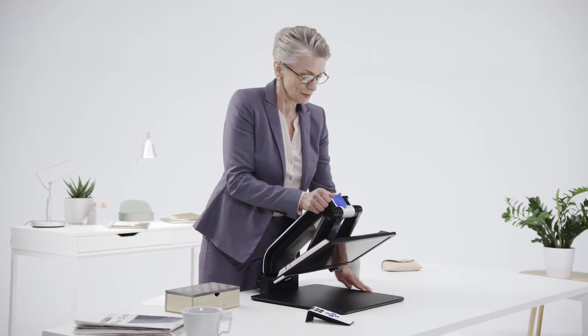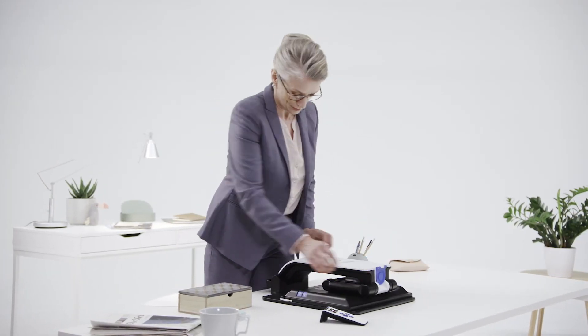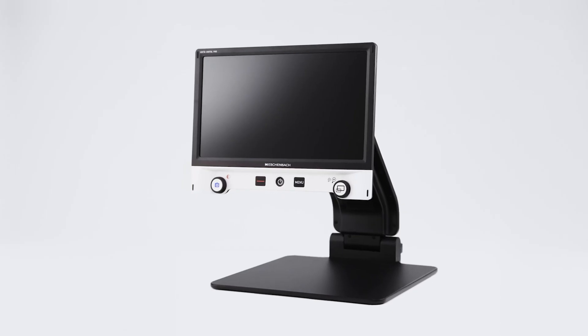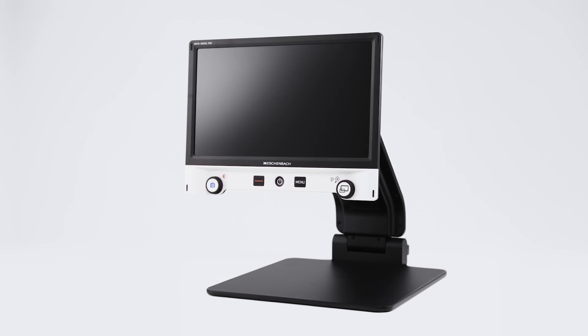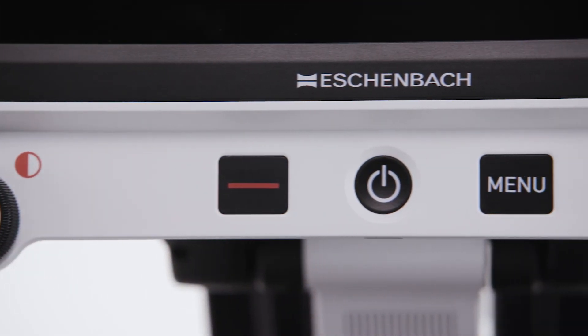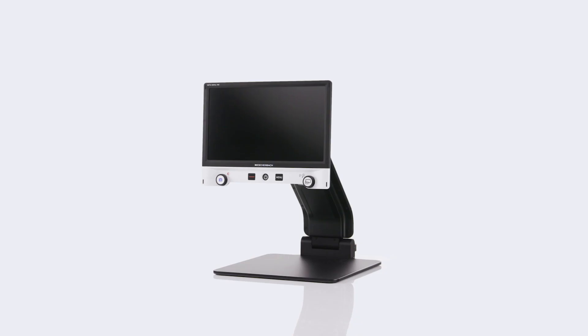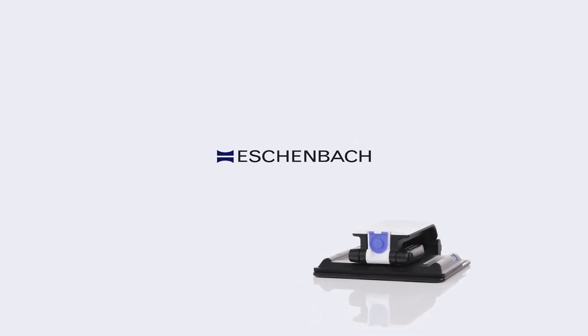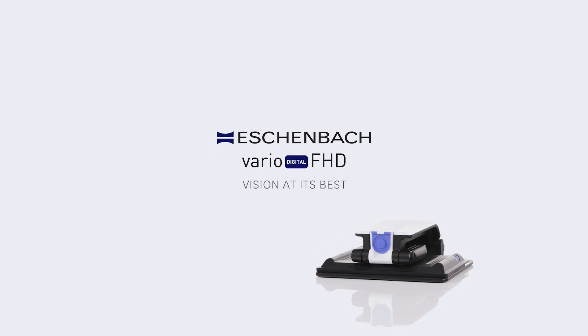The Vario Digital FHD combines flexible design with a user-friendly interface. Thanks to a high range of magnification, outstanding image quality and intuitive operation, it provides the ideal video magnifier solution for reading and leisure viewing while at home, work or school.